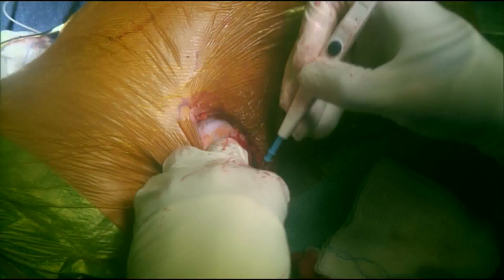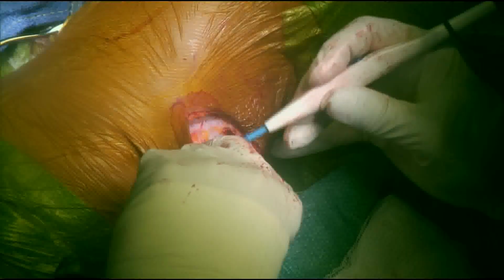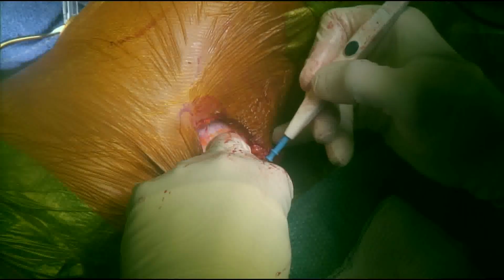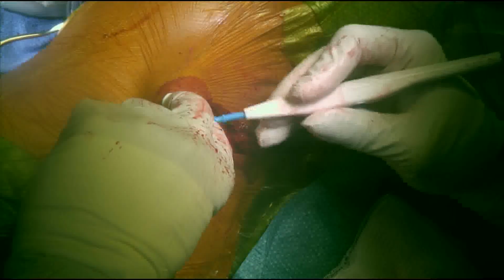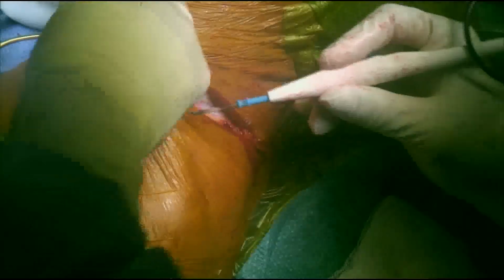Once the spinal catheter is fixed to the deep fascia, there is usually a portion of the catheter that remains outside the surgical wound. This can be cut at a later stage in the procedure depending on the required length for connecting the spinal catheter to the abdominal or pump segment catheter.